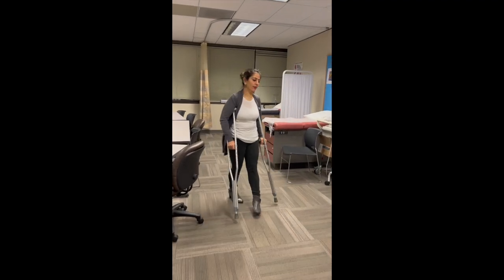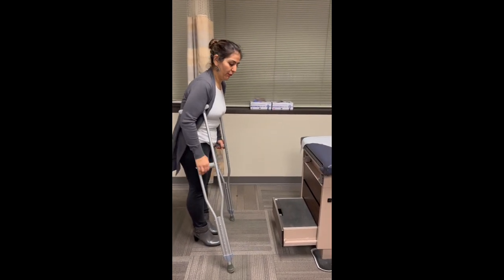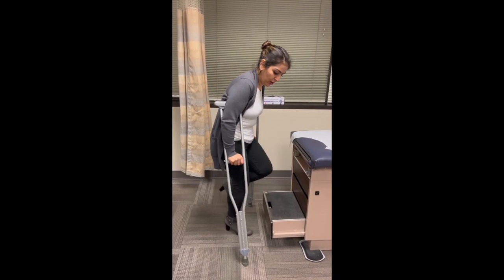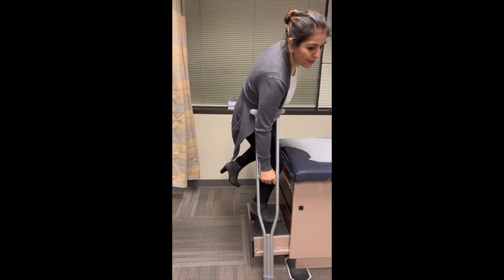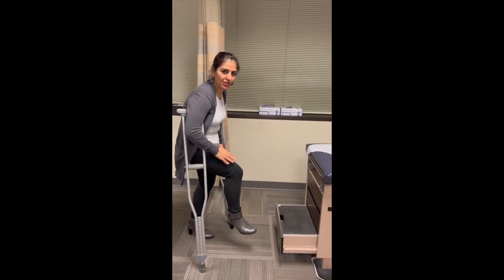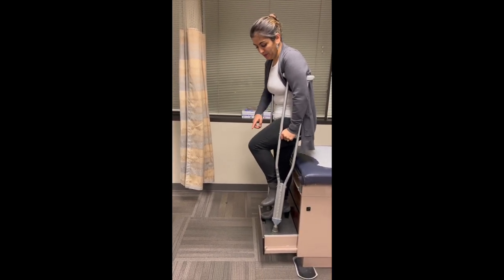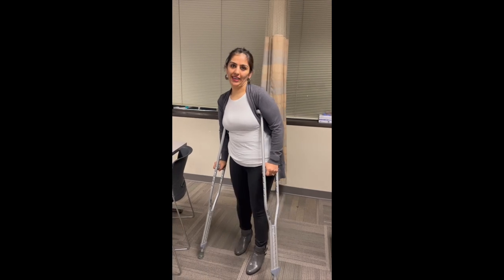For stairs, anytime we have stairs, if we're going up, our injured leg is going to be bent. I'm going to keep my non-injured leg go up first, get a good position, and then bring my crutches up next to it. Coming down with crutches: my crutches are going to go first, and then I get down with my non-injured leg.